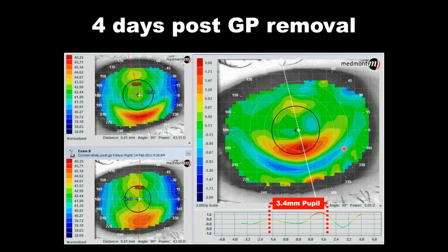Imagine if you have an 18-year-old patient that is showing some kind of inferior steepening, and you're wondering, is this a droopy cornea or is this a diseased eye that we should be following? Well, if we were to map the patient today, map the patient 6 months from now, do a subtraction, if we're seeing a hotspot popping up, we know that that eye is shifting.